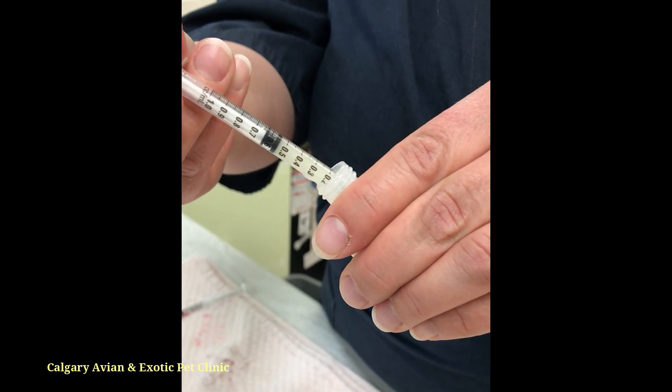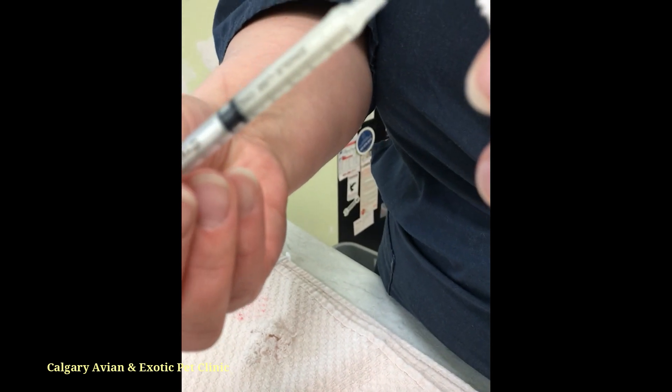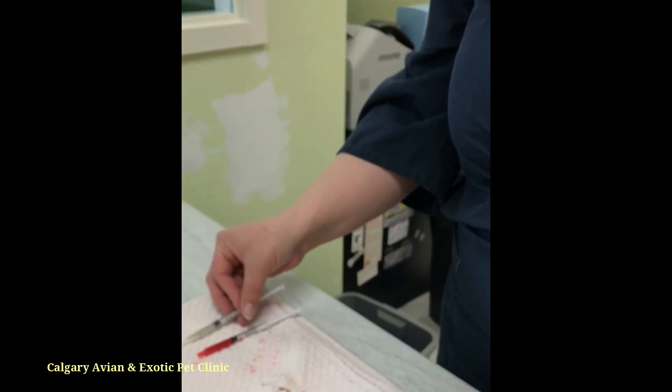The markings on the side of the syringe indicate how much liquid you have drawn in. If you draw up more than you need, replace the excess medication back into the prescription bottle.